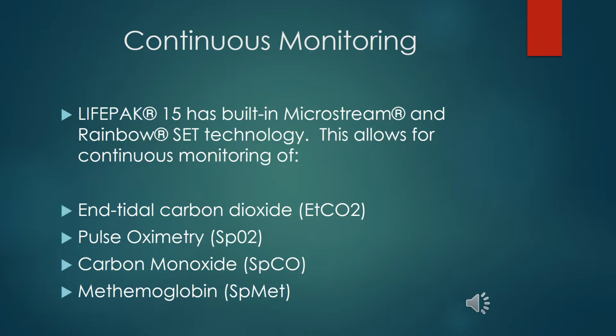This is very important for firefighters and EMS because the presence of carbon monoxide is a bad thing because it blocks oxygen from binding to hemoglobin. Same thing with methemoglobin. There are certain agents, which we'll cover here in a minute, that can make the iron on the hemoglobin convert from ferrous to ferric, which will not allow oxygen to be carried. So if the patient's deteriorating, this gives a quick reading out in the field to eliminate two causes right away.